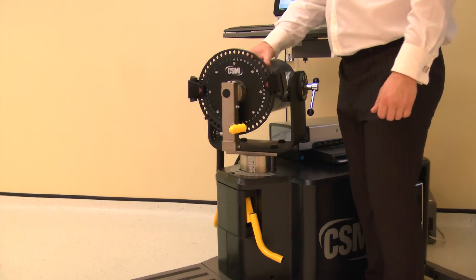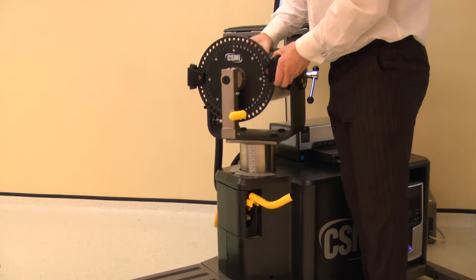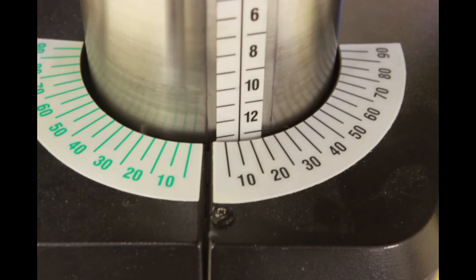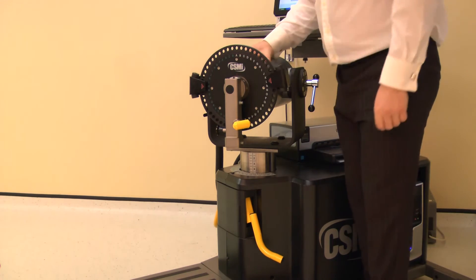The dynamometer height and rotation are adjusted together. Lift the locking handle to release. Rotate the dynamometer to 10 degrees on the black scale, whilst also adjusting the height to 13. Ensure both locking handles are pushed down to secure.